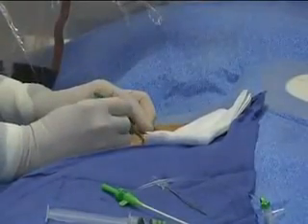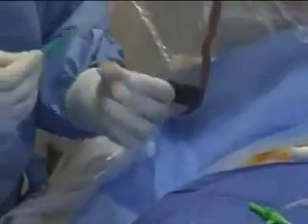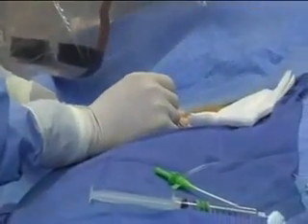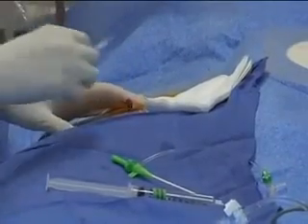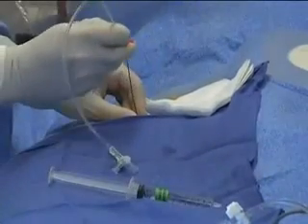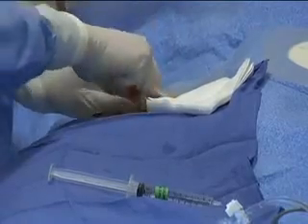A little pressure, sir. Little pressure in the leg there, sir. All right, and we put a sheath into the femoral artery in order to pass the catheters.